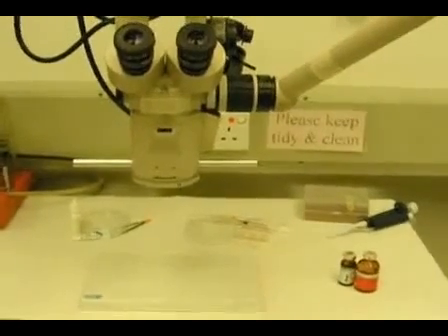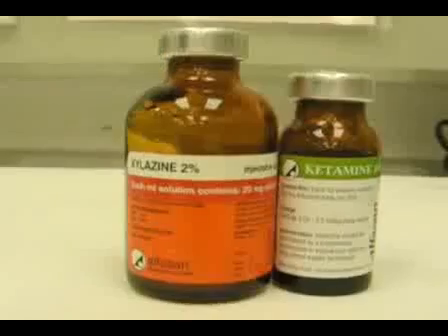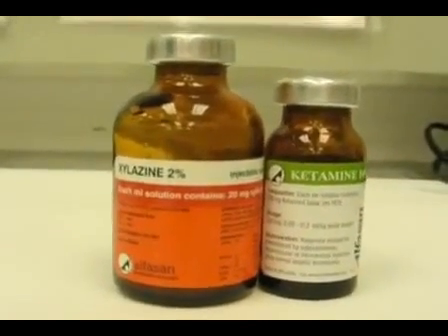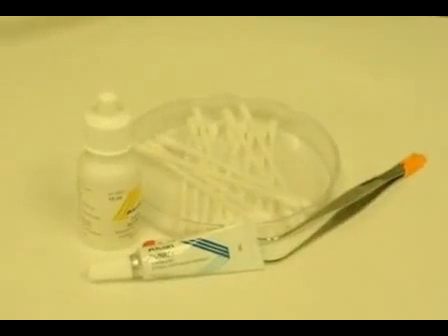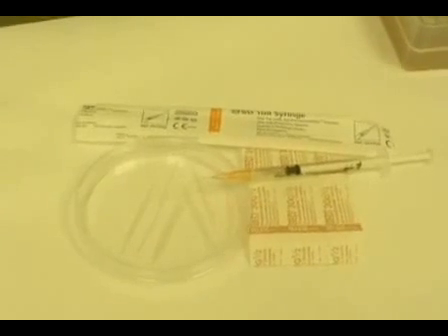We'll do the intraocular injection under the operation microscope. The rat will be anesthetized by a ketamine and xylazine cocktail. Local anesthesia and antibiotic ointment will also be used. We use a glass pipette to do the injection.